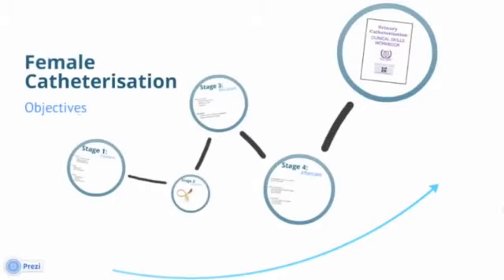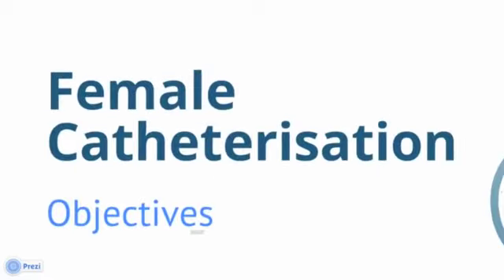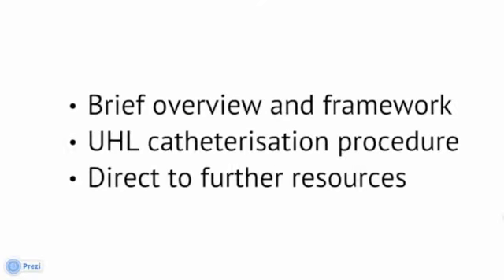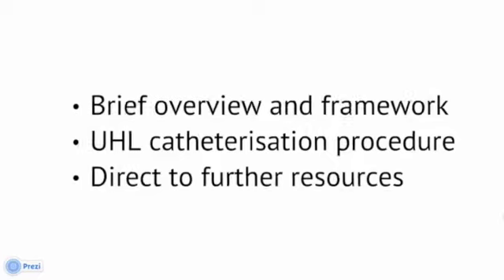Welcome to this clinical skills video. Today we are going to be focusing on catheterization. The objectives of this video are to provide you with a brief overview and framework for performing the catheterization procedure following the UHL guidelines. We will also direct you to further resources which contain more detailed information.